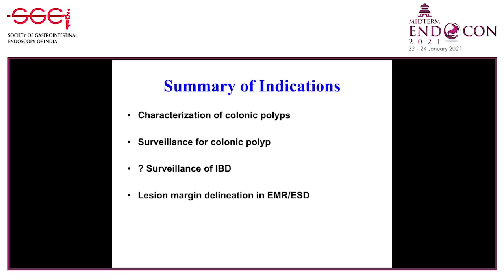Currently, the main benefit is in characterization of colonic polyps. There is emerging evidence to say that it may be beneficial in surveillance of colonic polyps as well. The data for surveillance of IBD is not there as yet, but it has been shown to be as good as a dye spray chromoendoscopy. And finally, NBI can be helpful in delineating the margin of lesions during EMR and ESD.